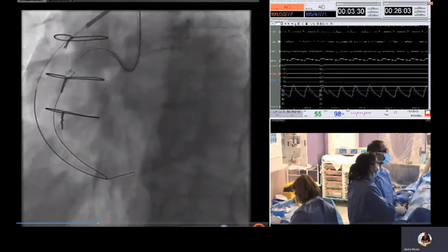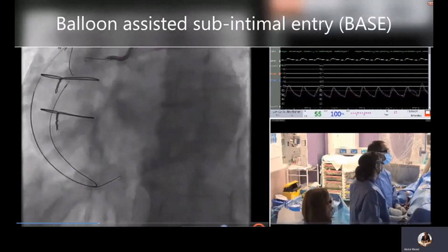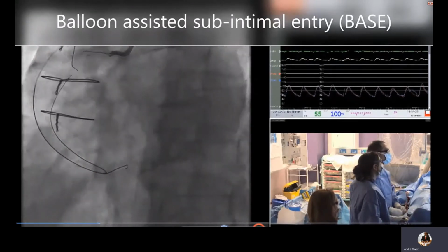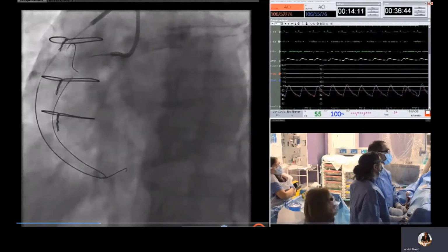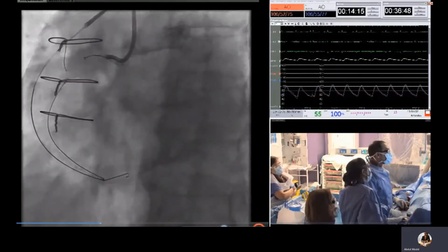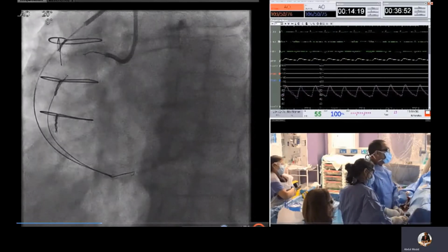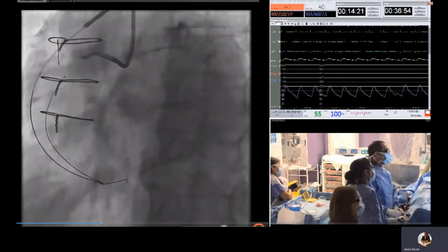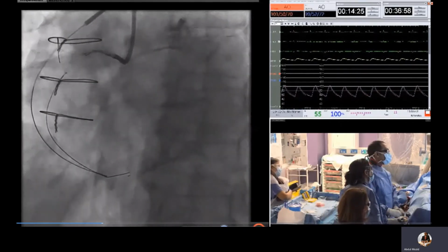There are several options at this point. We can take stiffer wires, either retrograde or antegrade, but this can lead to issues with stiff wire perforation. So one of the safer things to do is to perform deliberate dissection, and this is performed using a balloon, so-called balloon-assisted subintimal entry or BASE.